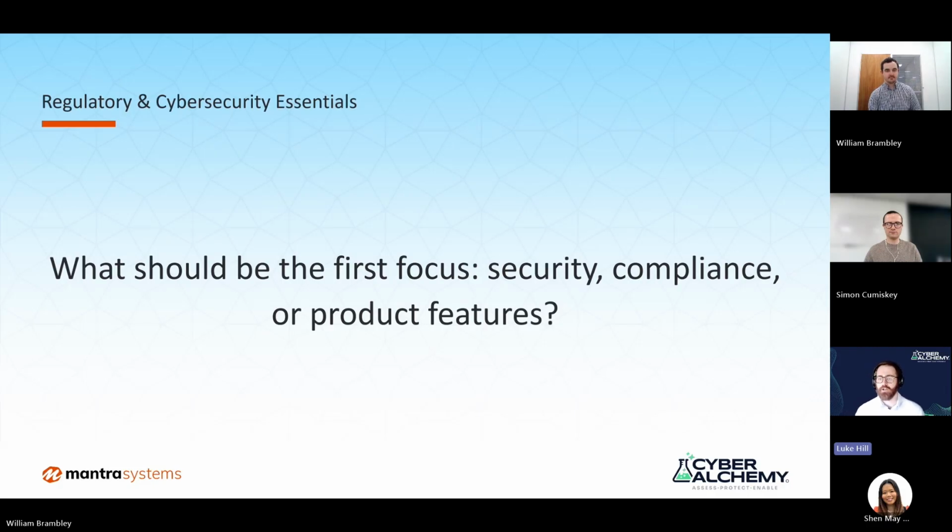That said, early on, I'd recommend that there's lots of planning, so you understand what the correct requirements are, and you've got a bit of a pathway to that. And bringing in lifecycle standards like IEC 81001, and getting your security architecture right and doing some light touch threat modeling.